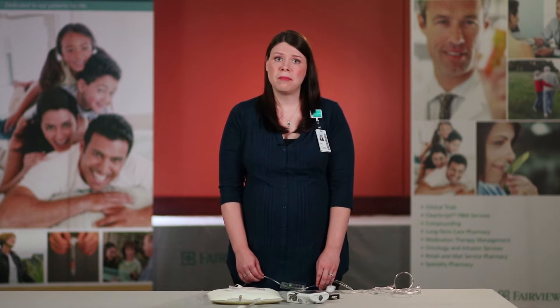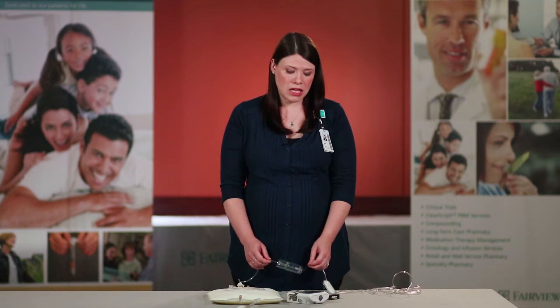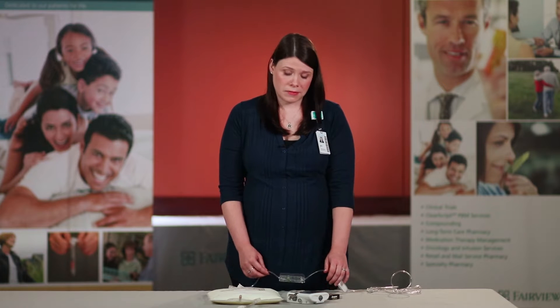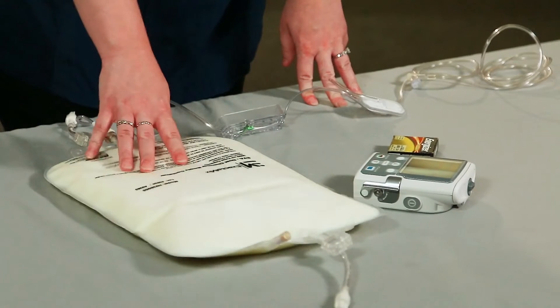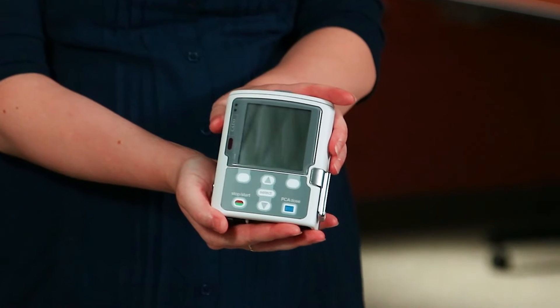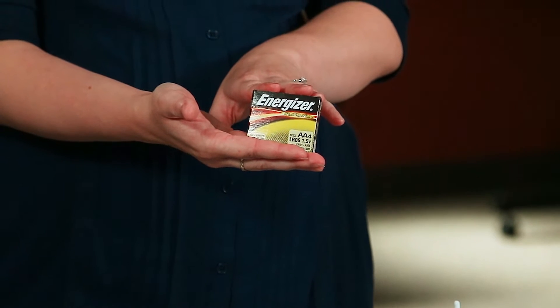In this chapter we will be discussing how to turn on your pump, how to attach the cassette of your TPN bag, and also how to prime your tubing of your TPN. The supplies that you will need for this are your warmed up pre-mixed TPN, your CAD Solus pump, and your package of AA batteries.